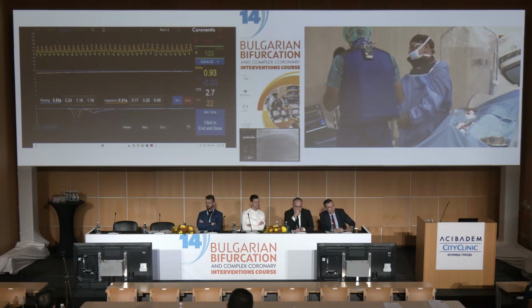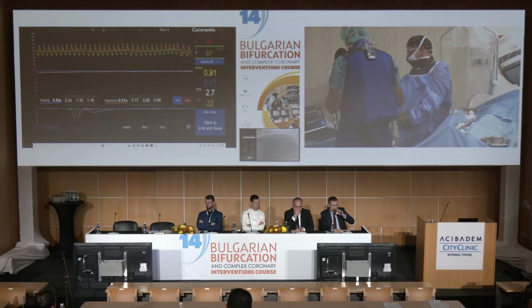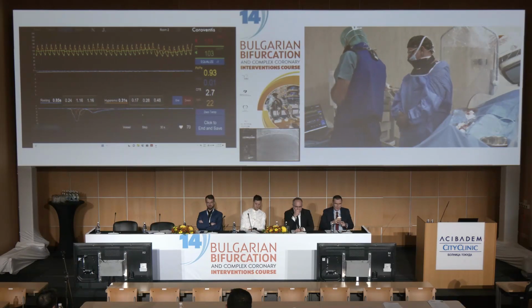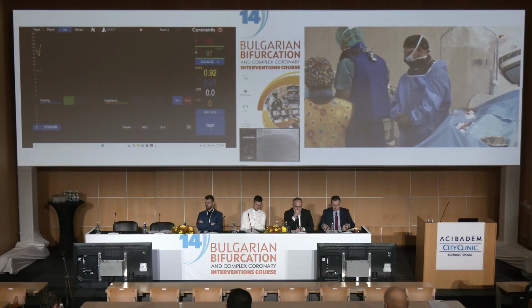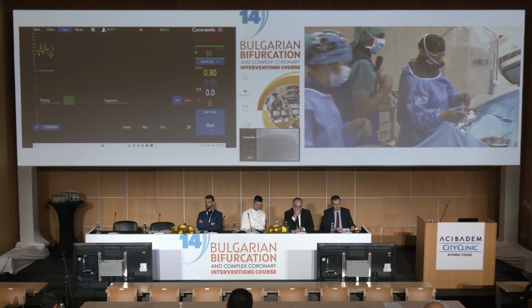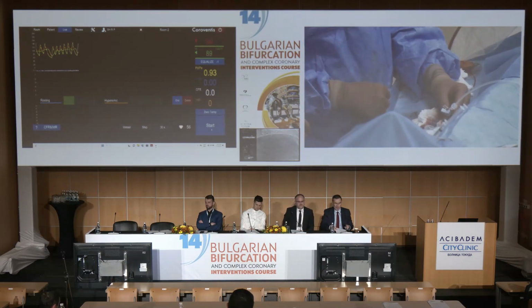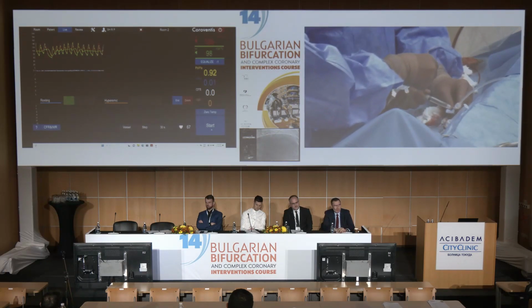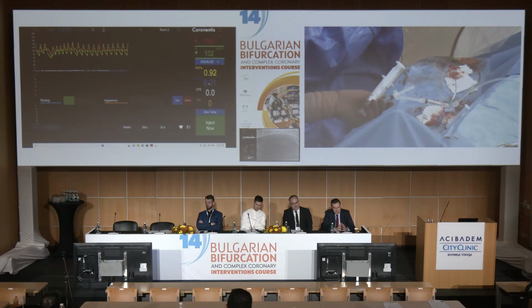So what I would suggest is to repeat everything once. We have time, there is no reason to rush, but it's better to do it well, okay? So we are going to click and save this recording and to go live again, and I would propose to repeat everything. So we need 3 times a bolus at rest, and I will tell you when to do it because the patient is still probably a little bit hyperemic, so we can zero the temperature again.